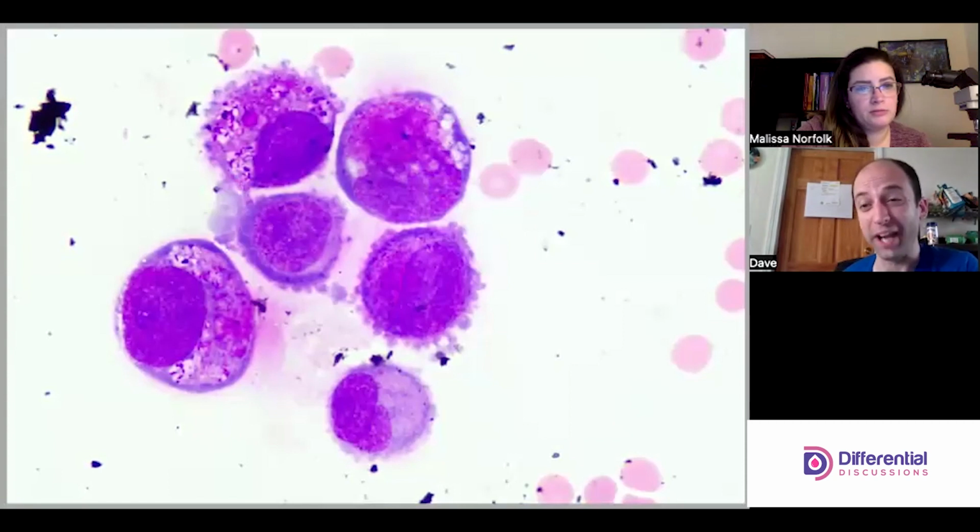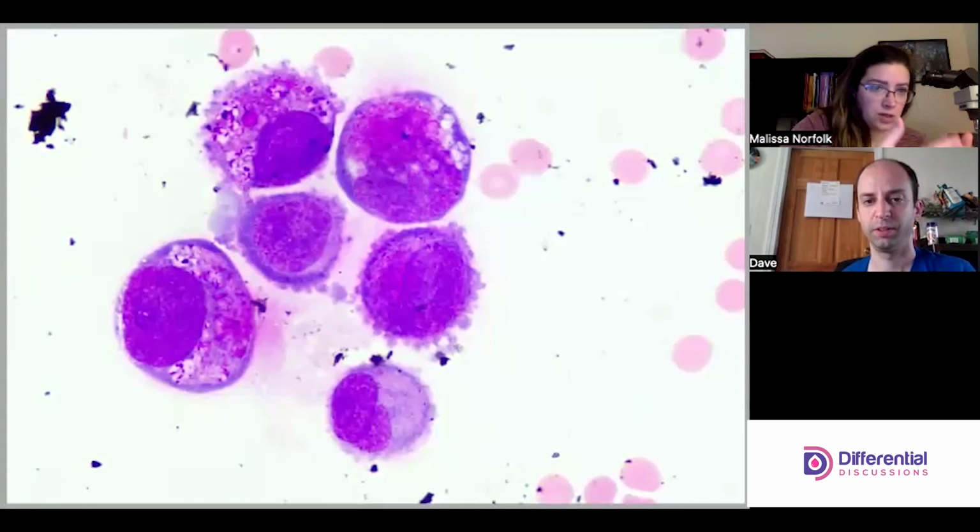They're also quite rare to have leptomeningeal cells in a CSF. And you may hear them called choroid plexus cells. Same thing, but they're the lining cells of the CSF. So we don't call them lining cells, and we don't call them mesothelial cells. We call them either leptomeningeal cells or choroid plexus cells. But they don't look like this.